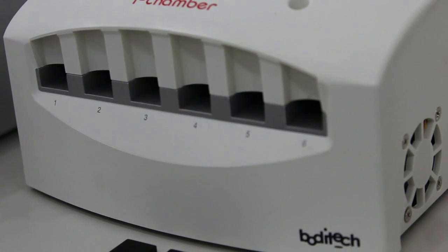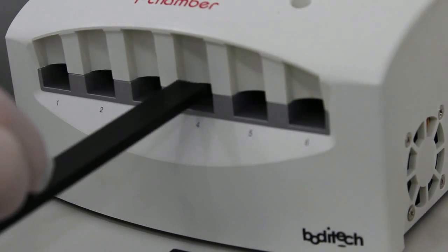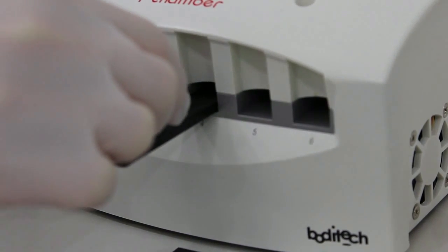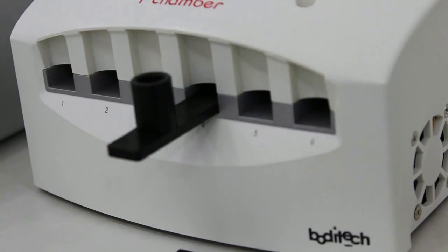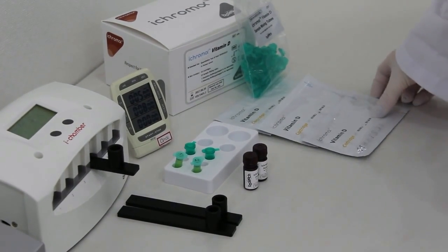Insert the tube block into the iChamber slot at least 10 minutes before the test. Don't push it all the way inside so as not to trigger the timer.